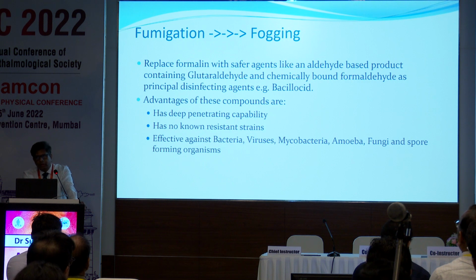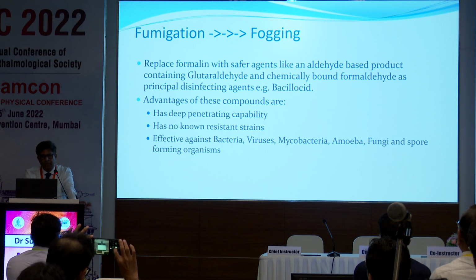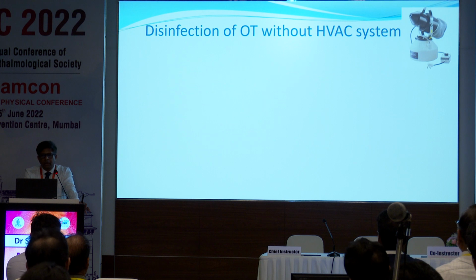Now, as the awareness is increasing, we are moving away from fumigation to fogging in OT where there is no HVAC system. Here the formalin is being replaced with safer agents such as aldehyde-based products, glutaraldehyde, and the advantage is that they not only have deep penetration capacity, there is no known resistant strain, and they are effective against all sorts of organisms.